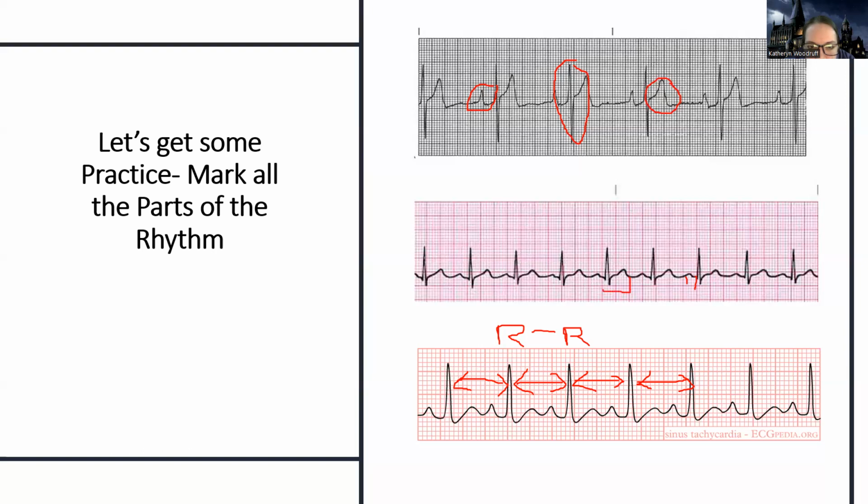See how that one's about. Let's even go up. QT interval. So I'm going to mark it QT, like the gas station, and then PR interval. But these are just here to give you practice, because I find that it's helpful to kind of look and see, okay, let's bring it all together. And what are things supposed to look like? So we're going to get a lot of practice with this.